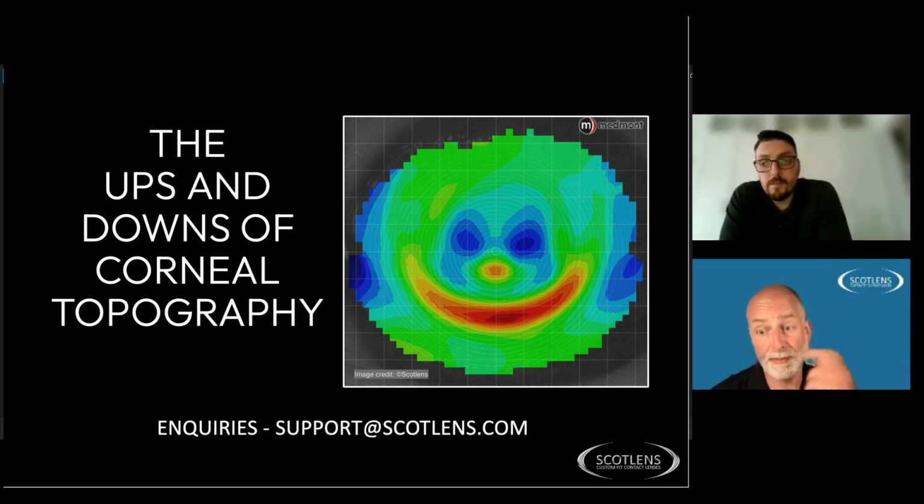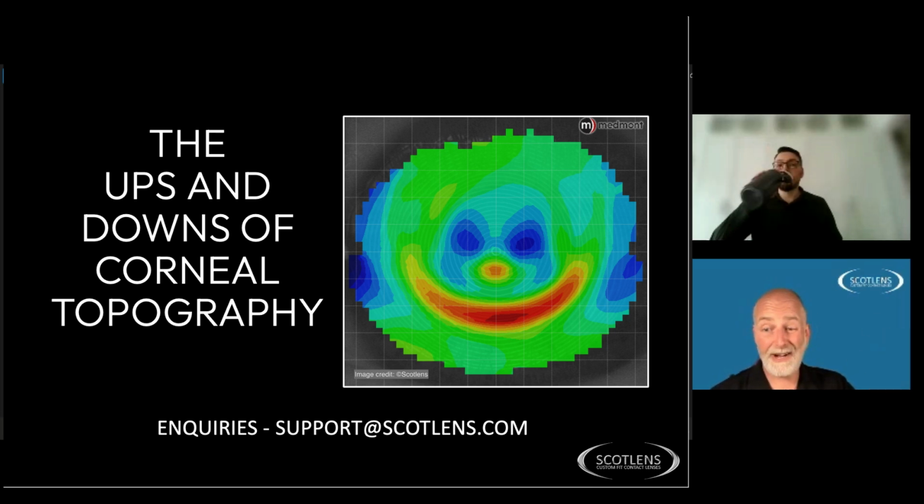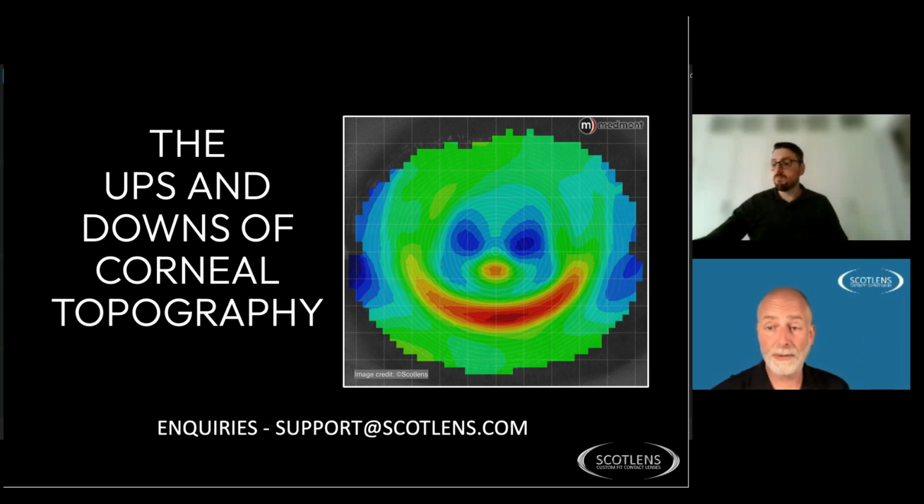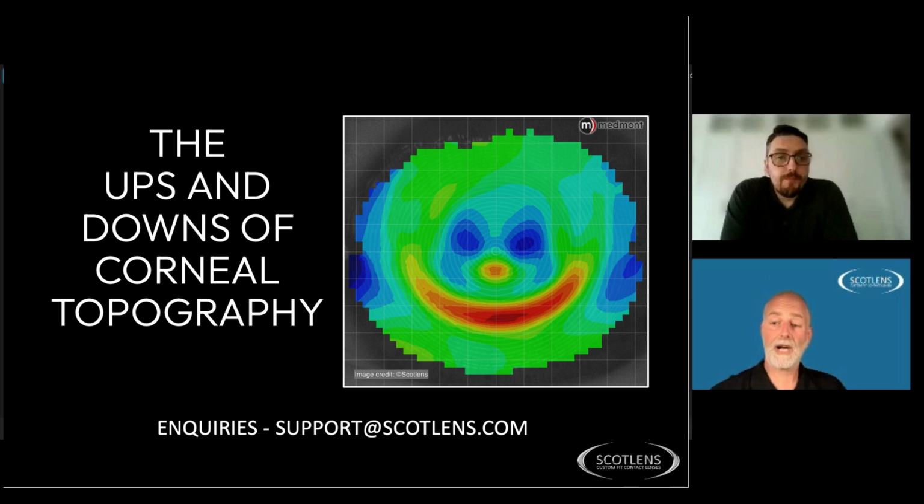There was a question popped up there: what types of patients are suitable? The patients that I like to fit are up to a -5 correction that they would get with a spherical soft contact lens. That's the ideal patient. Those patients are going to get a full-time correction and won't need to top up. If you go higher or they've got higher cylinders, they'll have a bit of a residual prescription that they might need to top up with glasses over the top. So it's looking for patients that are going to be 20/20 happy. Again, that -13, -11 patient was 20/20 happy, but had to top up with glasses fairly regularly because of the prescription in one eye.